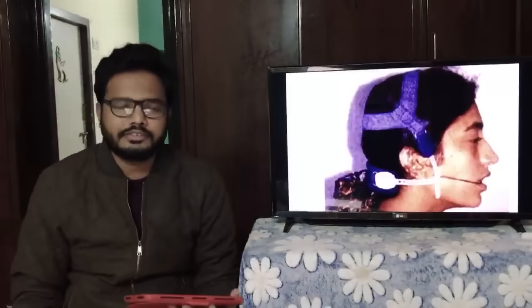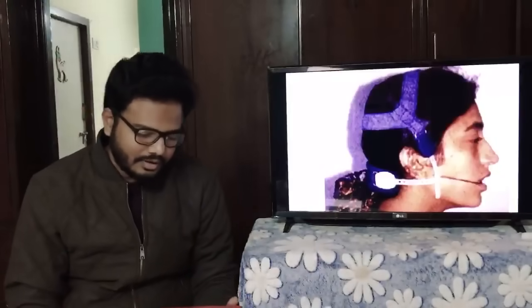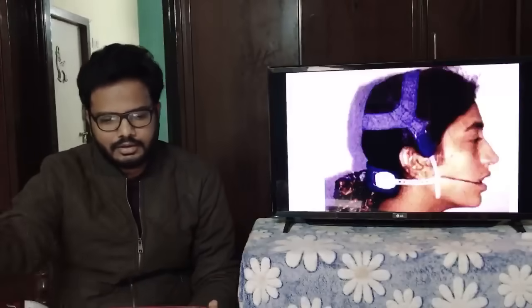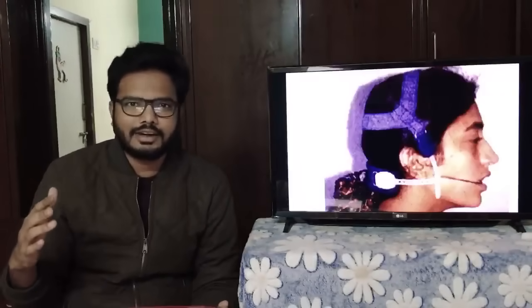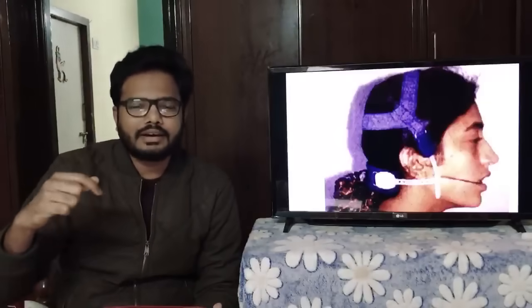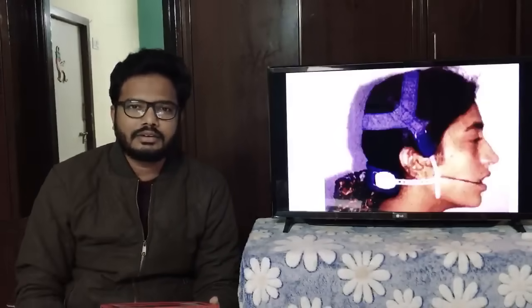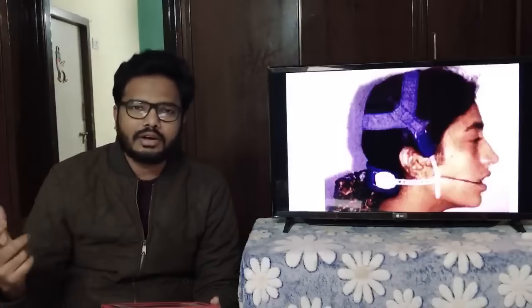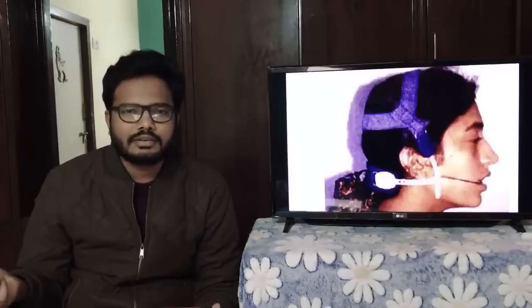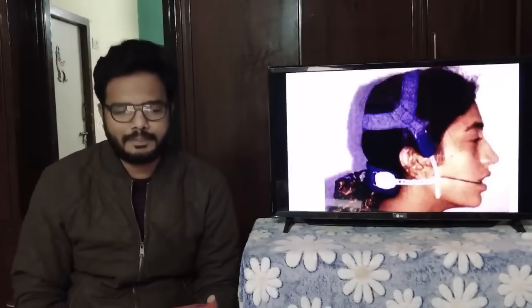So you can see straps, the cervical part of the head as well as the occipital part of the head. It's a headgear, that's understood. We have different types of headgears. So which type of headgear is it? Is it cervical headgear or a face bow kind? A reversible headgear, occipital headgear? So what kind of headgear is it?